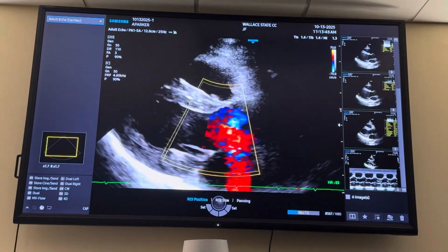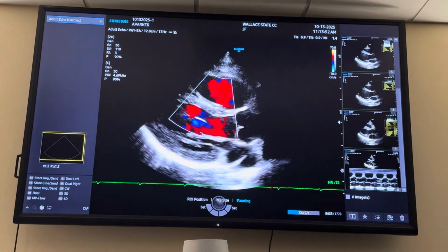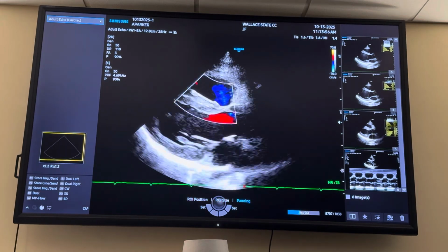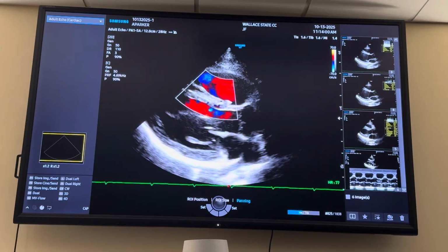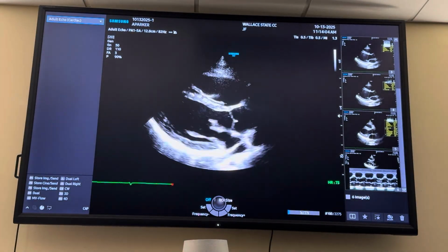you can move your color box, well, I would recommend sending that out up here on the interventricular septal wall. Because see, I'm not even focusing on aortic at all. You can just tell where my focus is now versus where it was over the heart valves. So I think we've covered all that.